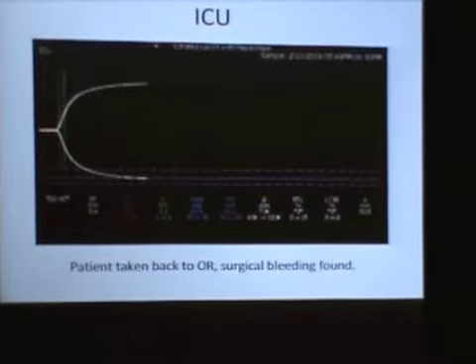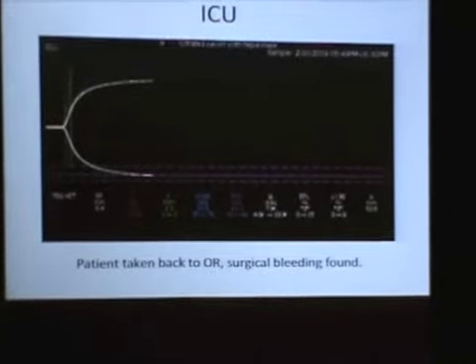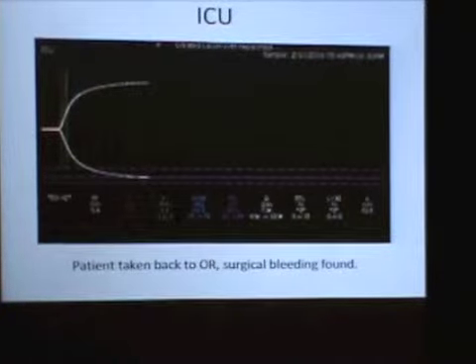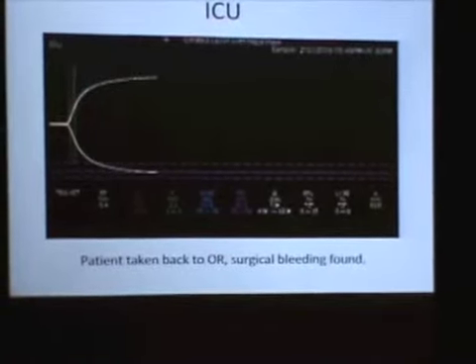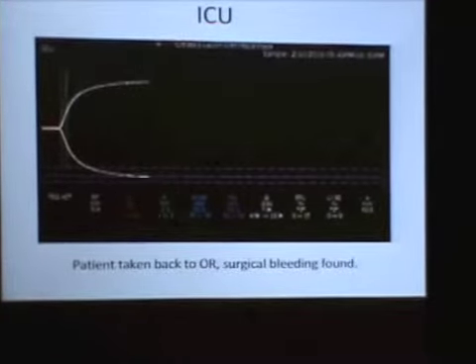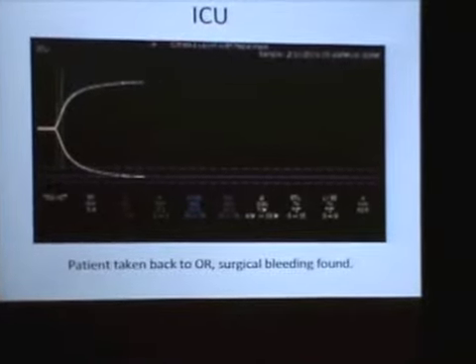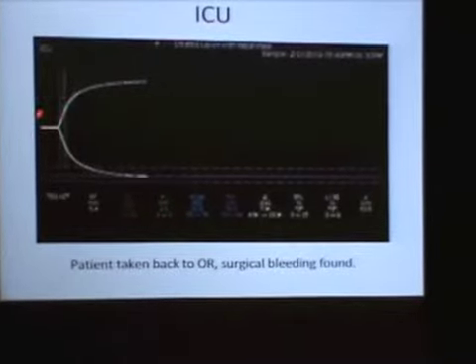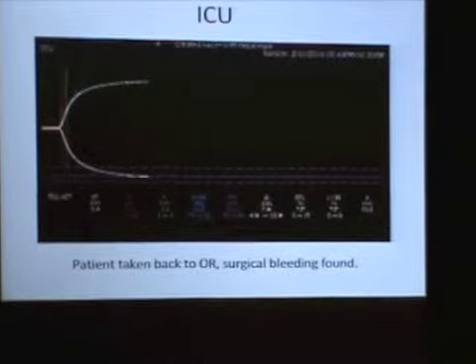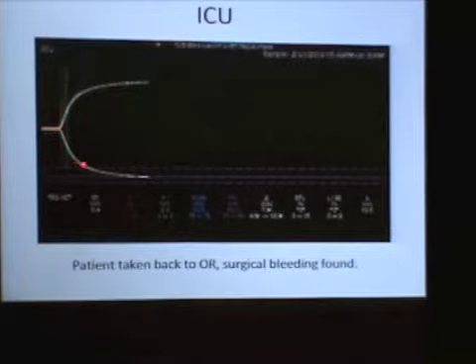And in the ICU, in the CVICU and in the ORs, you can actually see the curve and see the results right off the instrument, in real time. So you can call right away? Yeah, or you can call it up and see it happening. Because if the patient's surgical bleeding, 45 minutes is a lot. I agree, that's what I'm saying. While this curve is forming, you can pull it up on the computer in the ICU and see it forming in real time.